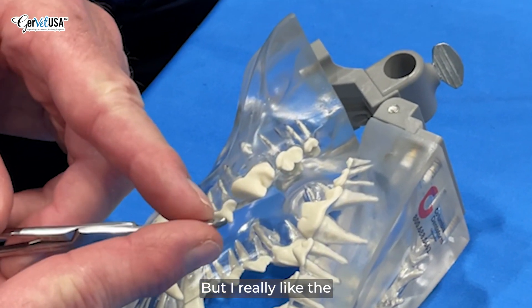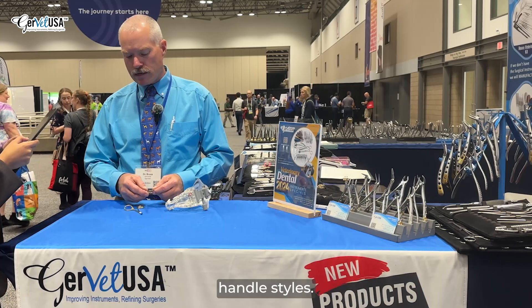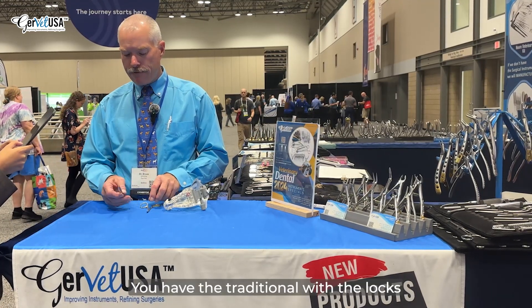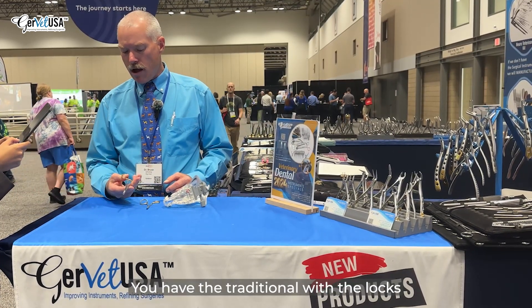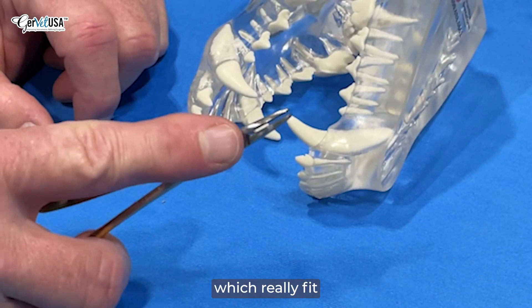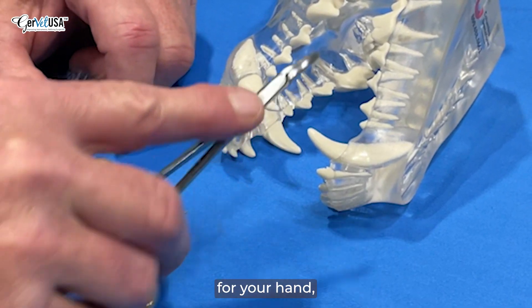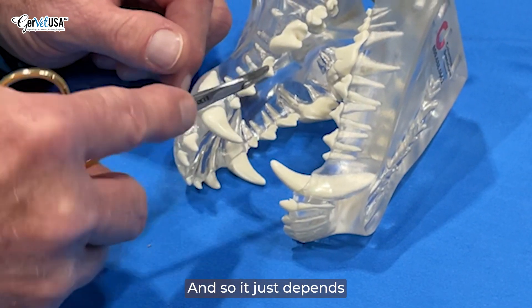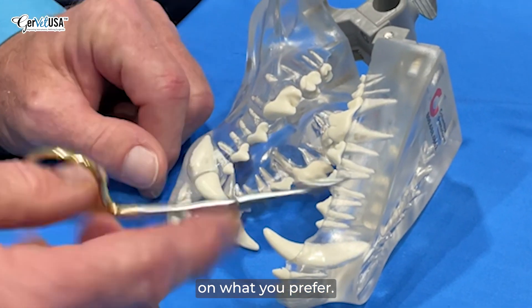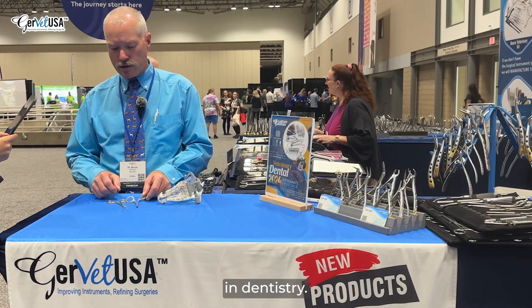I really like the curved tip on these. It comes in a couple different handle styles — you have the traditional with the locks, and then the offset handles, which really fit comfortable in your hand, but they do not have locks. It just depends on what you prefer, but any of the curved instruments are very helpful for suturing in dentistry.